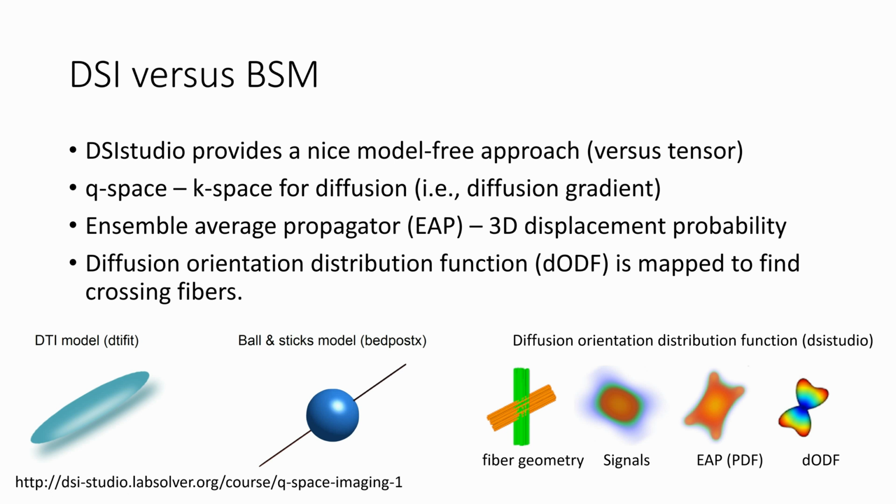But at that point, it's going to use a different way of calculating the likely fibers in the fiber crossings. We talked about the general DTI model. We talked about the bedpost model, where you're mapping out potential paths through, and the DSI approach is very similar. You start building up potential explanations of how that data is mappable. So you create a Q space. Now, Q space is, at least descriptively, like a K-space for diffusion.